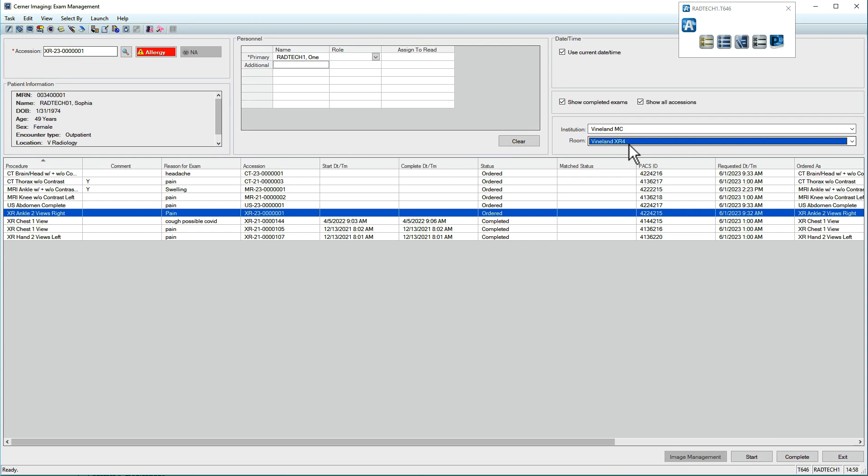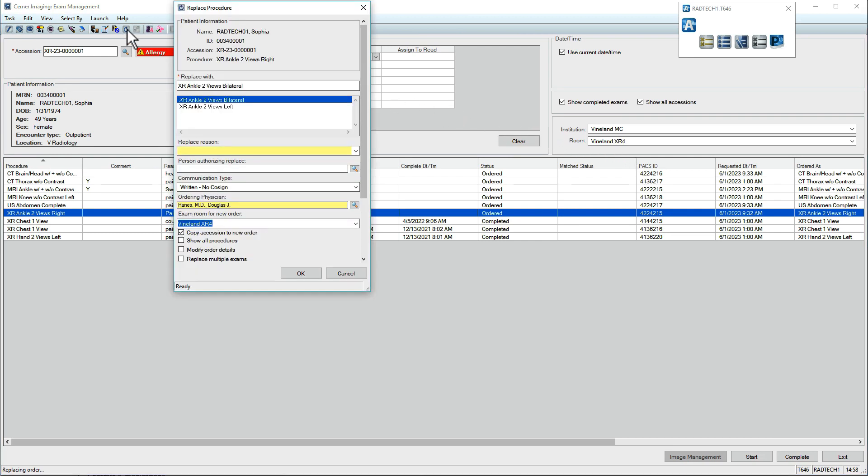In the upper left, click the Replace Exam icon. Current order information displays at the top and appropriate replacements display below. The system will only allow replacements of a similar type.